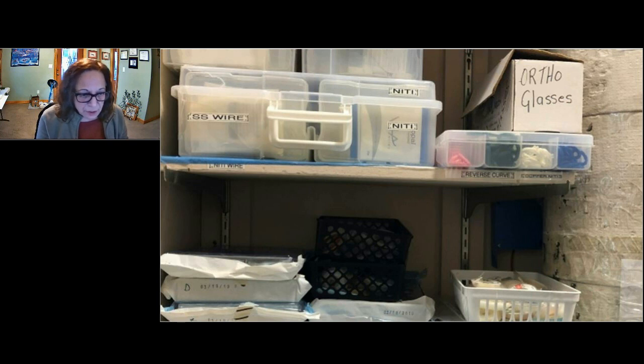The other part of sterile instrument storage is you want it in an enclosed cabinet with doors on it, or in a drawer, to prevent unintentional or inadvertent contamination of your items. And you also don't want your items handled a lot. The way these cassettes here are stacked, my guess is someone has to root through all this to find exactly what they're looking for. So you're continuously handling all these items.